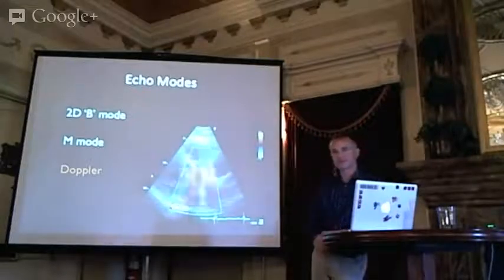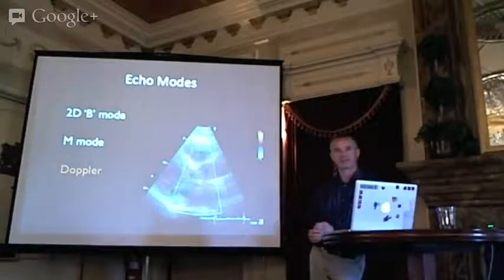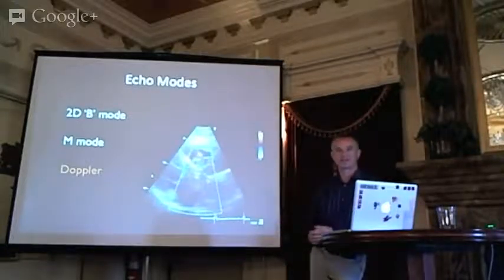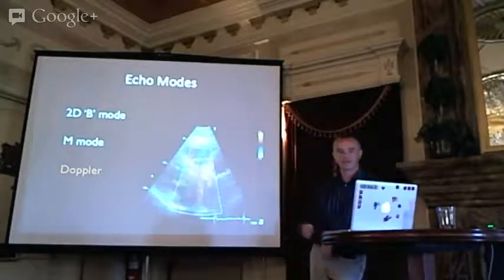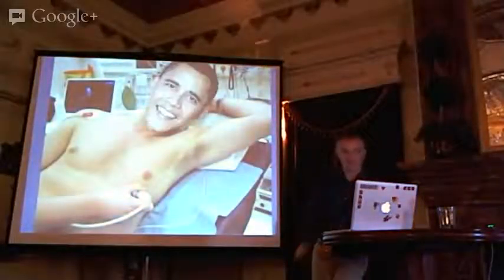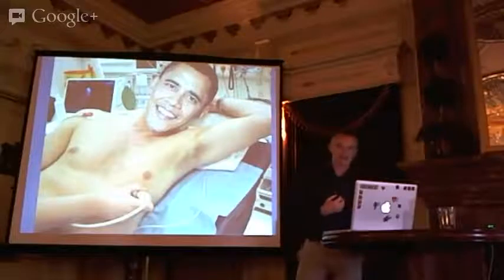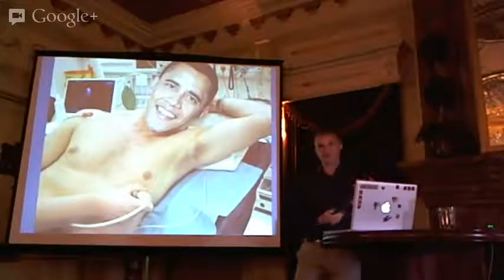So I said we'd talk about positioning. In any procedure in medicine, we have to get the position right to optimize our chance of success. We would never dream of having a patient in a bad position for laryngoscopy and intubation or when we do a lumbar puncture. It's the same with echo. Now, if you have the luxury of an awake cooperative patient, you can put them over onto their left side, and that helps the heart fall away from the sternum. And if they put their hand up behind their head, that will help spread the ribs apart as well, make it easier to see the heart.